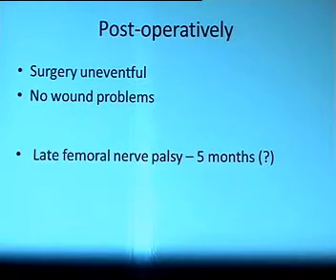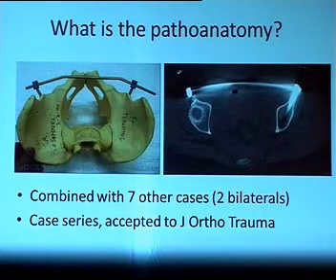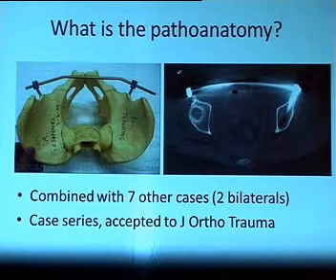So she returned to my office with a late femoral nerve palsy, talking about anterior thigh numbness of new onset and weakness in her thigh, and she had a new onset limp. A late femoral nerve palsy? What does that mean? Well, it may mean that I put my frame too low and have impinged on the femoral triangle, which was not discussed at the initial discussion by Vaidya.